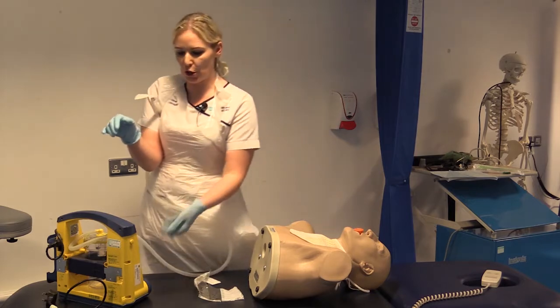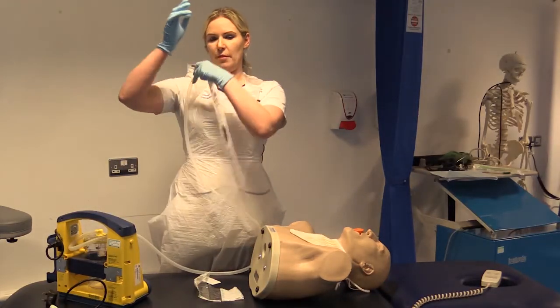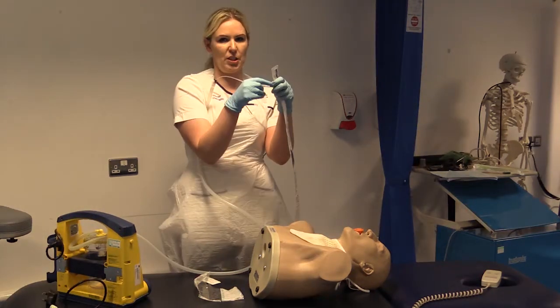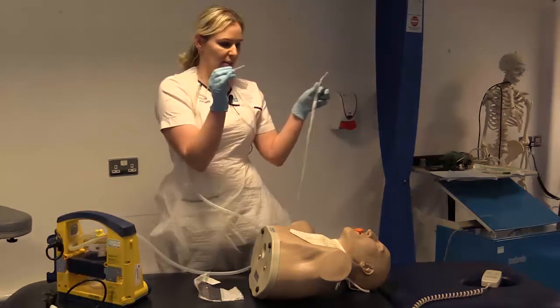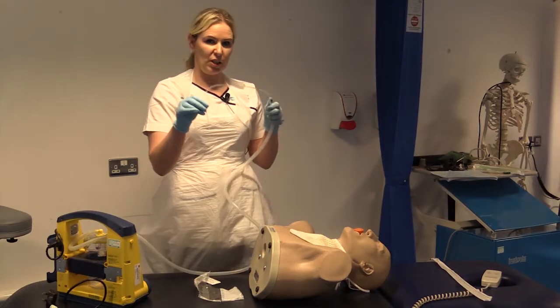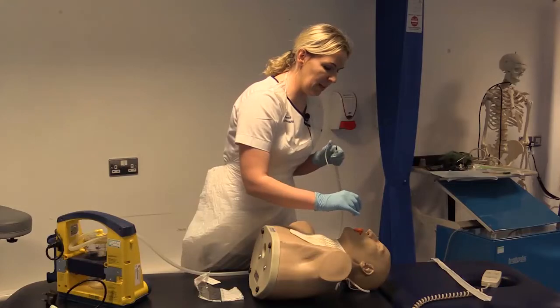We're going to turn on our suction, and again we're going to slowly remove our catheter from the sleeve, making sure our clean hand is the only hand that touches the catheter, and as we come out we're going to apply a thin layer of gel over the end of the catheter. Again, we're going to explain to our patient the suction is about to occur, and we're going to slowly insert the catheter into the airway.